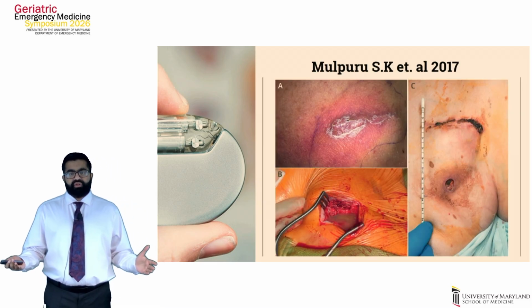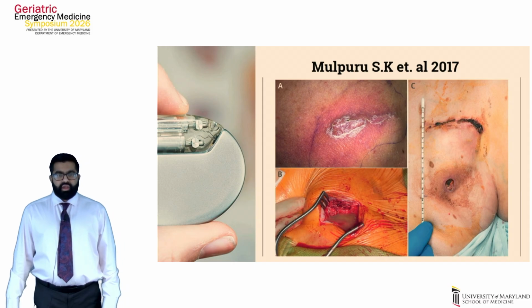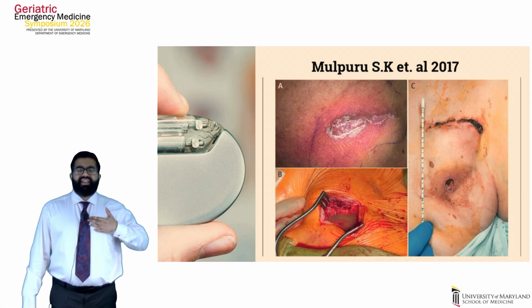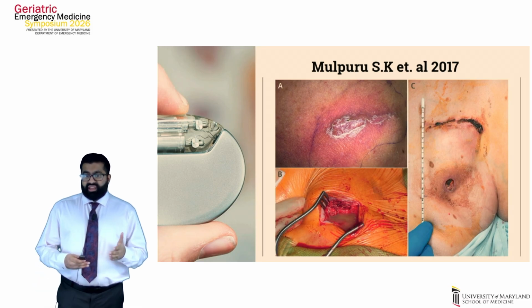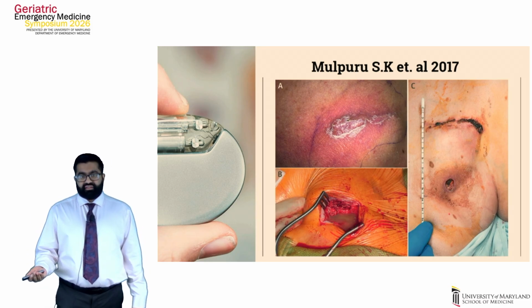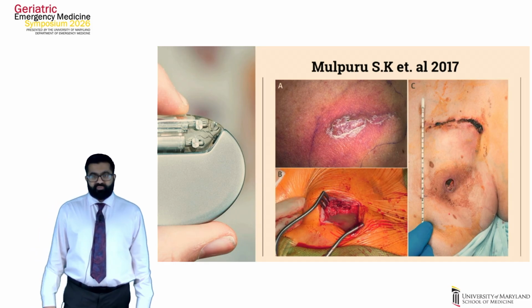These are some examples of pacemaker pocket infections. We can see in our first figure, there's a little bit of erythema and swelling at the site. This is actually a patient that had a pacemaker placed just 2 weeks prior. Now, these can go more advanced. You can have erosion of the skin. You can have purulent discharge buildup as well.